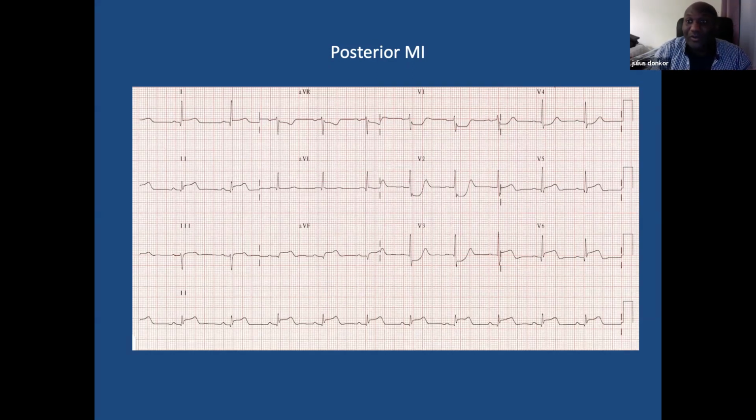Some of the books will say that if lead 2 shows a higher ST elevation, and you've got ST elevation in the lateral leads, the dominance is probably the circumflex. Because if it's the right coronary, the PDA is stretching all the way around the back, and it's not likely to stretch enough to the high lateral LV wall for the ECG to show ST elevation there.